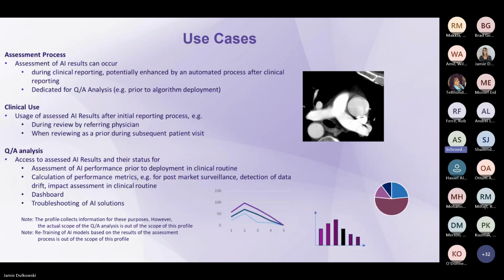So now let's look into the whole assessment of AI results. Basically, if you look into use cases, we need to cover the actual assessment process, which can occur either during a clinical reporting process where a radiologist selects valid findings or clinically relevant findings that he or she wants to see in the actual report.